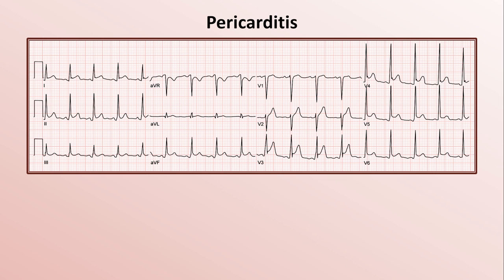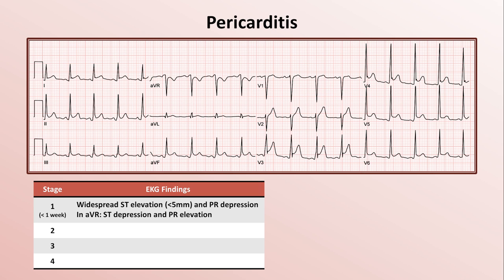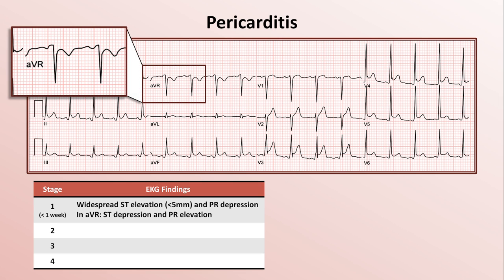The EKG findings in pericarditis are sometimes described as having four stages. In the first, seen within the first week after symptom onset, there are widespread ST elevations less than 5 mm in height, along with PR depression. Additionally, in AVR specifically, there is ST depression and PR elevation. We see that PR elevation in AVR demonstrated in this EKG. In Stage 2 there is normalization of findings. Stage 3, the timing of which is very variable, consists of widespread T wave inversions. Stage 4 is normalization once again.